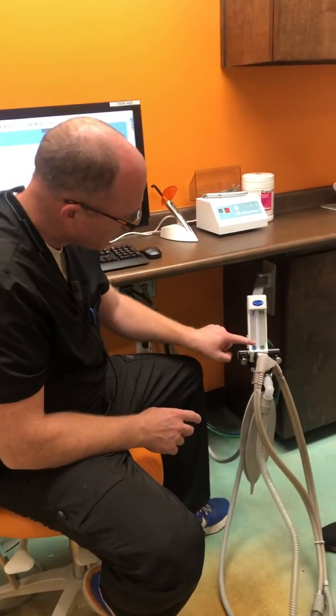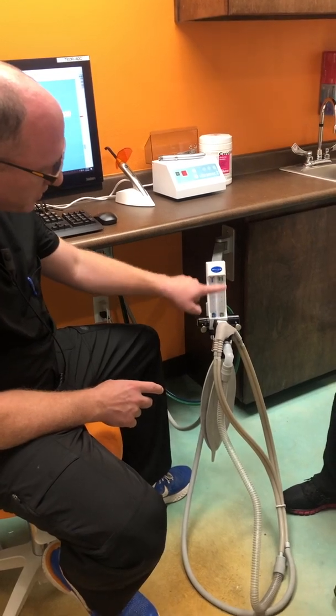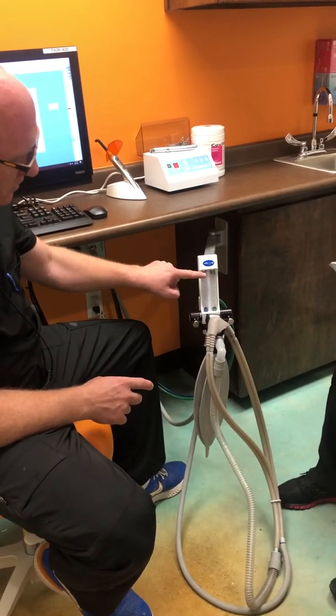On the left-hand side you'll see the blue dial right here, and on the right side you'll see the green. The green is the oxygen, and the blue is the nitrous oxide.